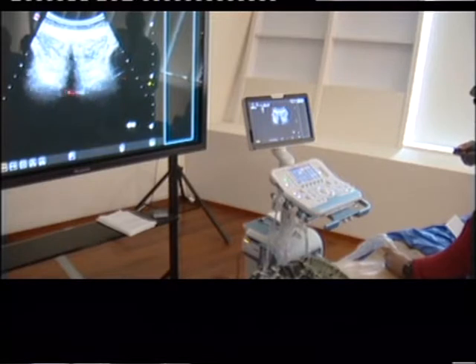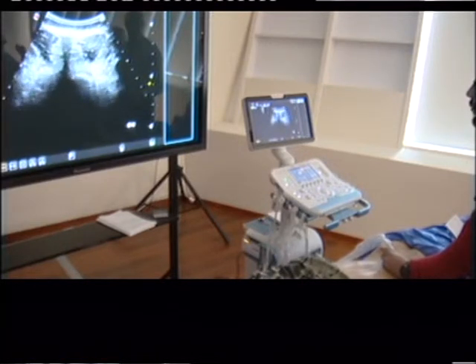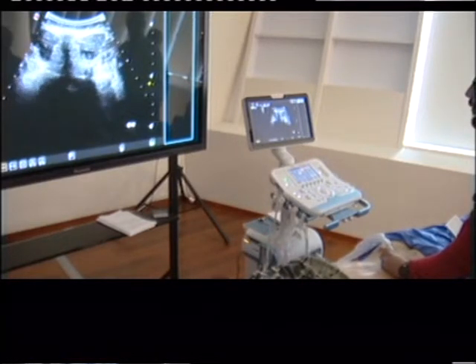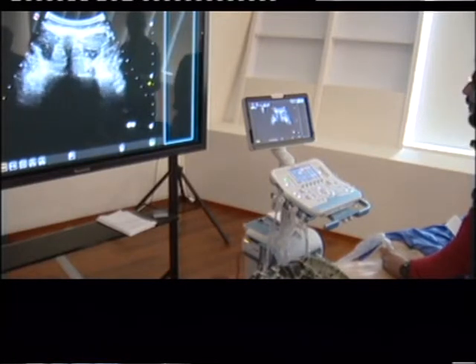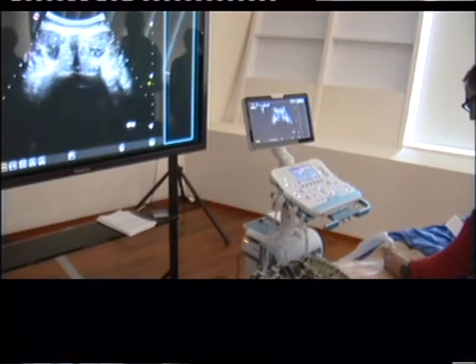See this is the lumbar, longitudinal, so all the way through. Now go to 4. Facet. There's L4. There's the posterior longitudinal ligament here.